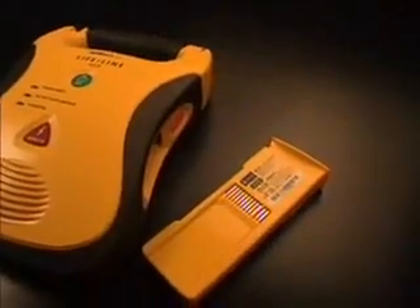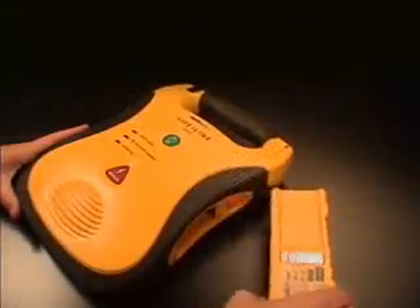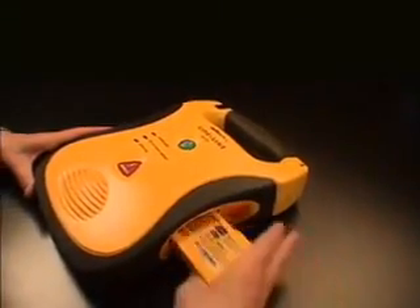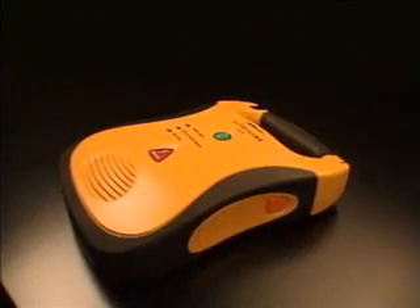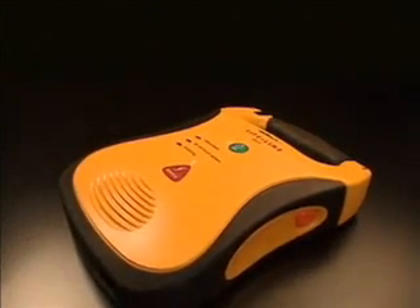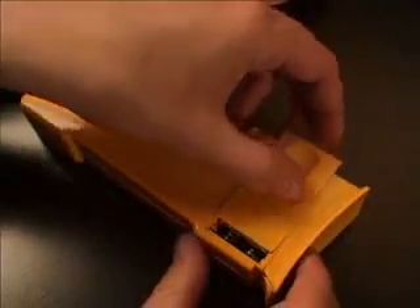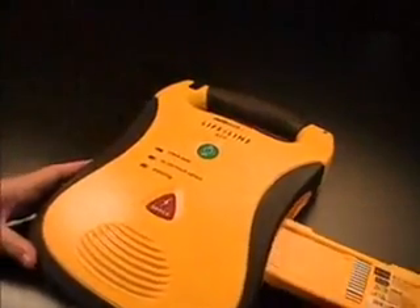The Lifeline AED is powered by a long-life replaceable lithium battery pack. Insert the battery pack into the Lifeline AED by pushing it into the battery compartment, label-side-up, until it clicks into place. If the battery pack is inserted upside-down, a stop will prevent it from going in all the way. If a 9-volt battery is installed in the battery pack, when the battery pack is inserted, the Lifeline AED will automatically run a self-test to confirm that the battery pack is ready to perform a rescue.